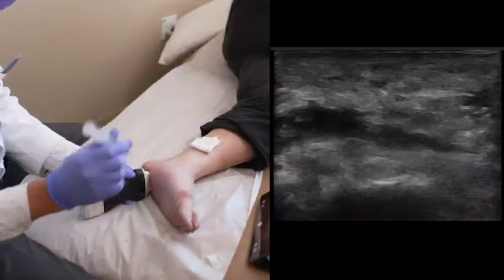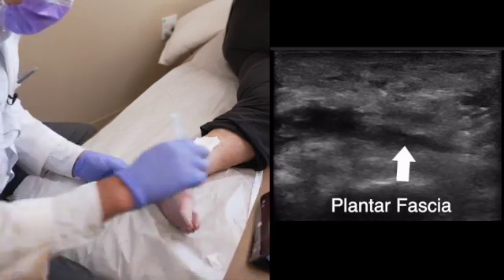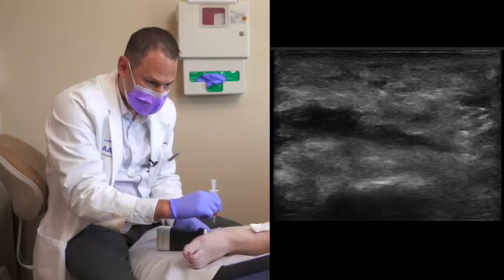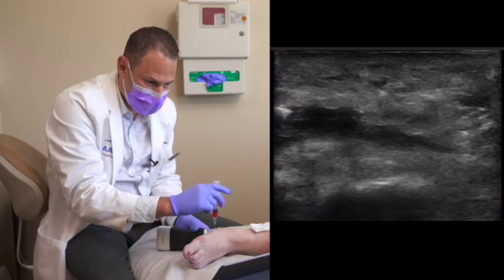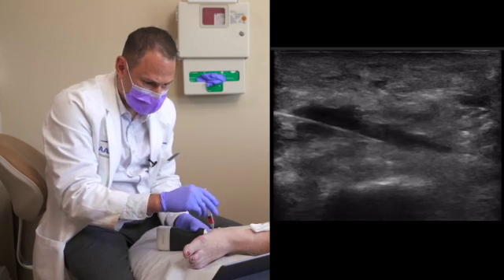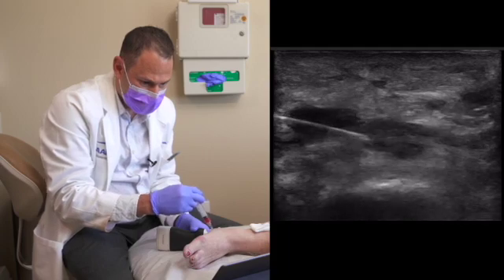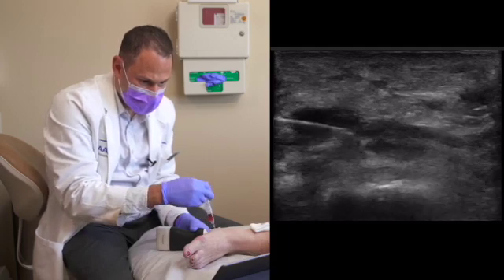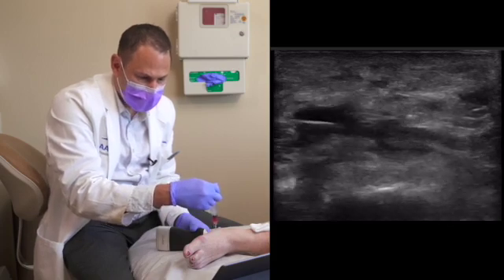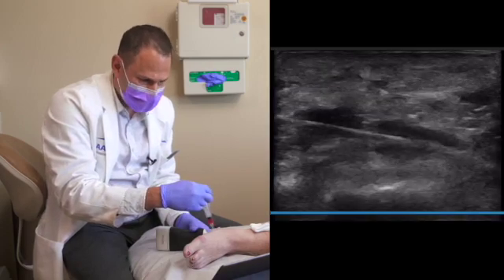Now I'm going to insert the PRP, aiming for the plantar fascia. You can see my needle entering into the fascia. I'm depositing the PRP superior to the fascia as well as into the fascia. If there's resistance, I'm not injecting. You may be a little sore after, but it's going really well — nice and smooth. This is the way it should feel.